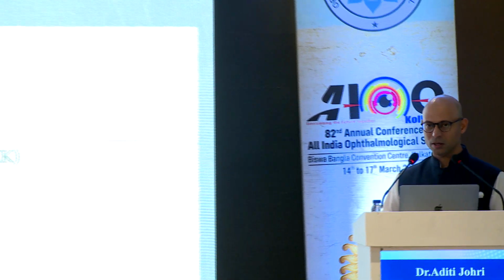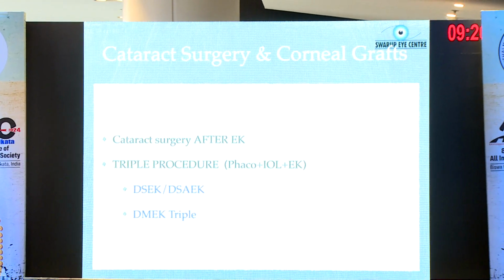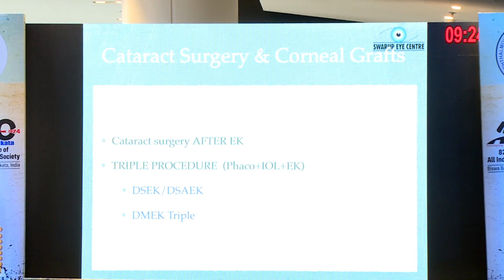So the topic given to me is cataract surgery in endothelial keratoplasty. It's a very focused topic, and I'll try to give some of the important tips when dealing with a cataract in a patient who has either already had an endothelial graft or is in need of an endothelial graft simultaneously with the cataract surgery. So I'll describe both situations. A combination of cataract surgery with endothelial graft is called an EK triple, and that could be a combination with either a DSEK or a DMEK.